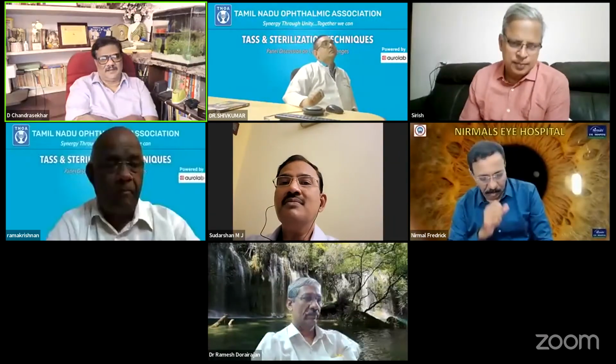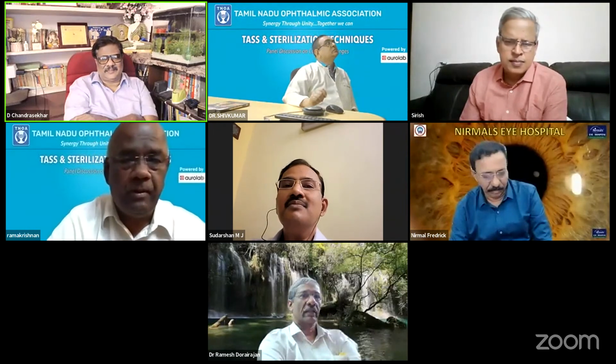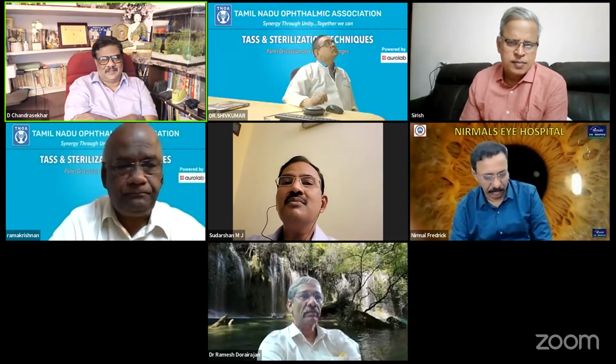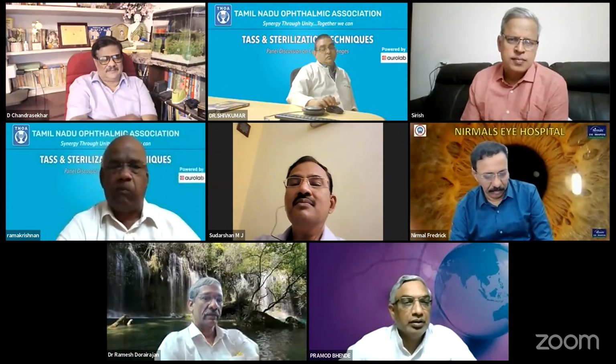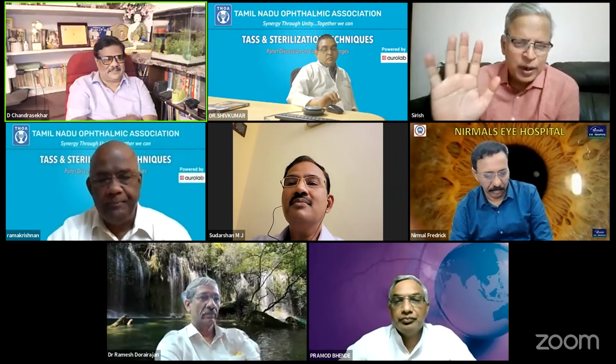Thank you, Krishna Kumar. I think we also need over 140 degrees to kill these endotoxins. Normally, an autoclave will have only 120 degrees. These endotoxins will survive at 120 degrees, isn't it? Yes, 160 degrees, sir. Thank you for your inputs, Mr. Krishna Kumar.